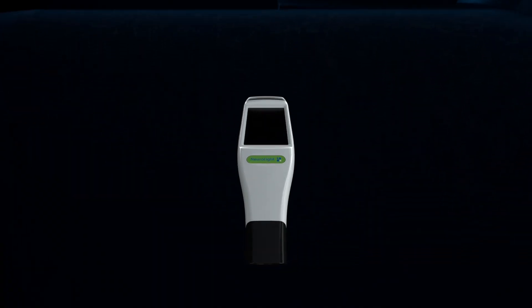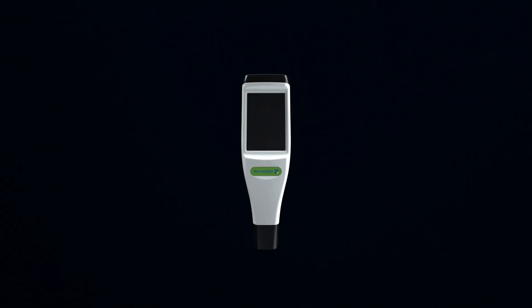This is NeuroLight, a pupilometer made by medical professionals, not an office supply store. It's a new era in pupilometry.